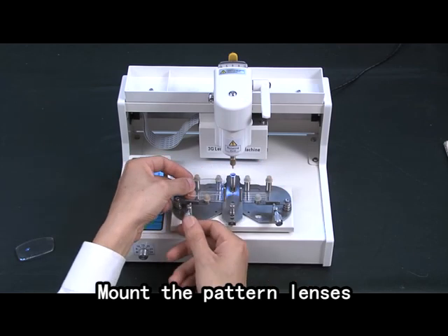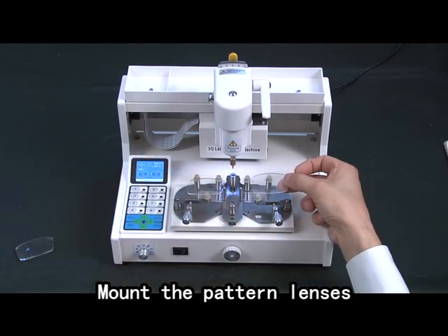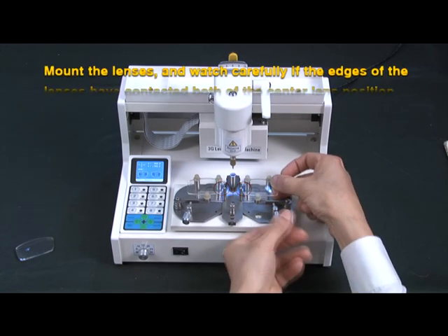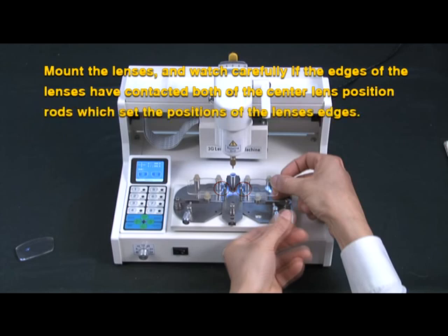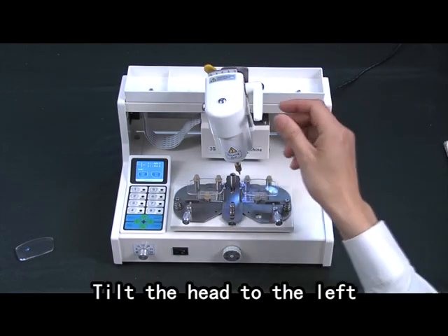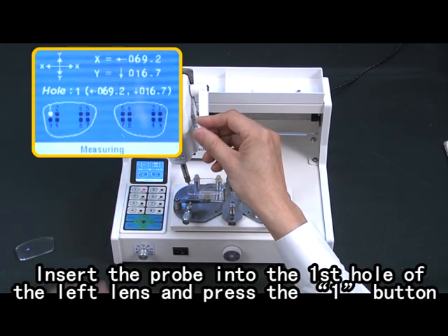Mount the pattern lenses. Mount the lenses and watch carefully if the edges of the lenses have contacted both of the center line's feeler rods. With the edges of the lenses aligned, tilt the head to the left. Insert the probe into the first hole of the left lens and press the one button.